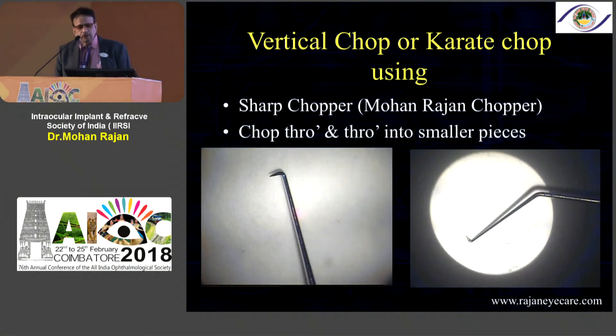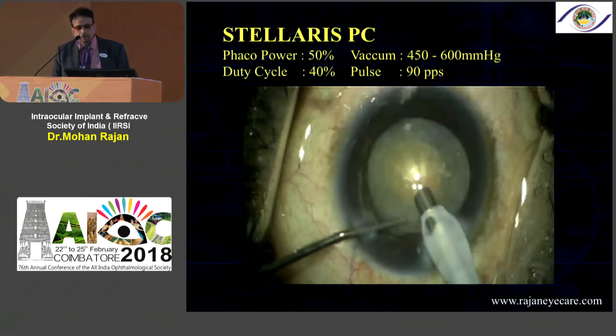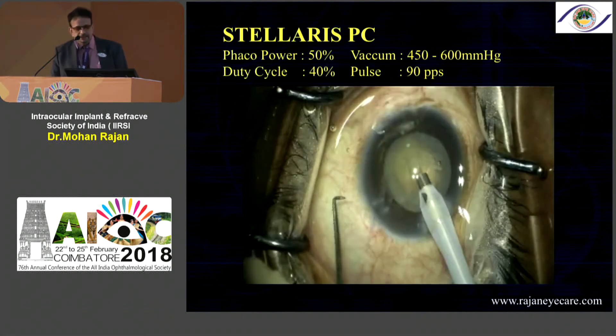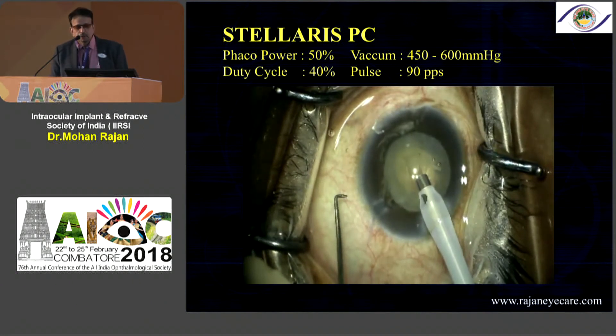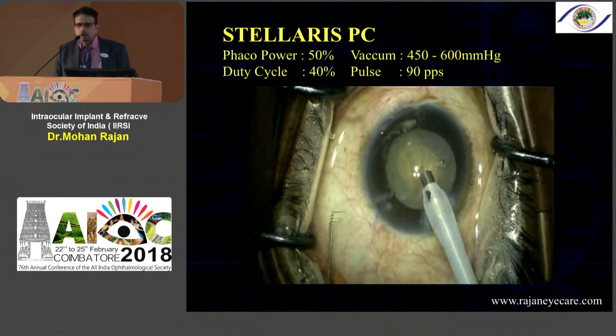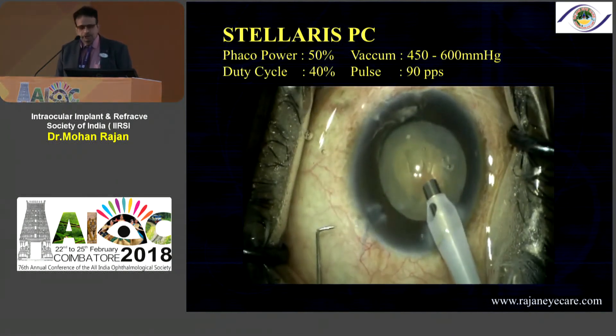In supra-hard cataracts we combine the technology. I've developed a sharp chopper available at Appa Swami — it comes in 1.5, 1.75, and 2 millimeter sizes. You can see here what I'm trying to do is straight away make a small trench and throughout this you use the same parameters. You can see how the sharp chopper works: what is important is you have the bevel down and go straight.